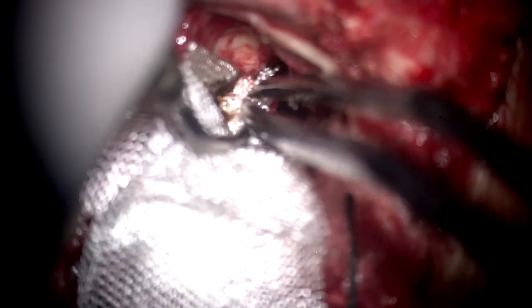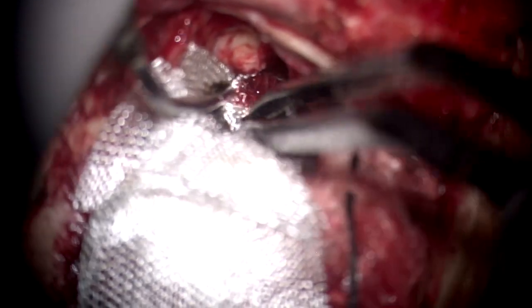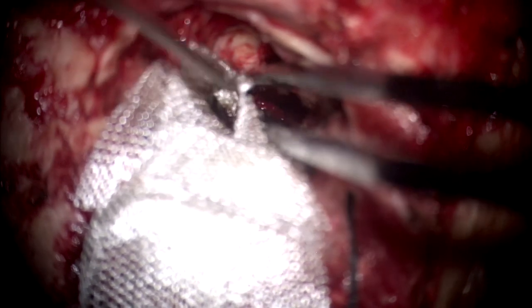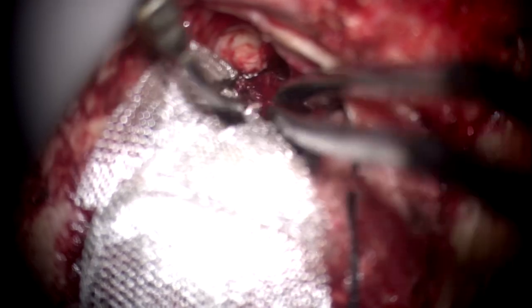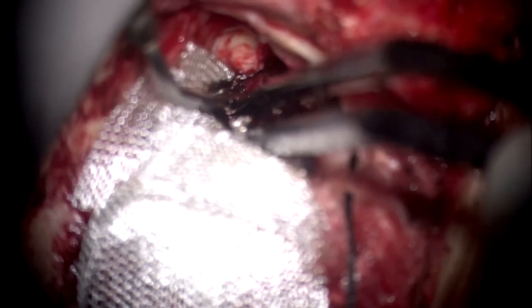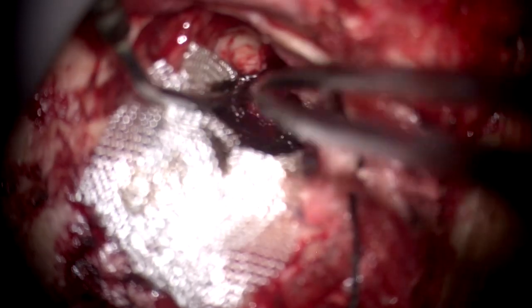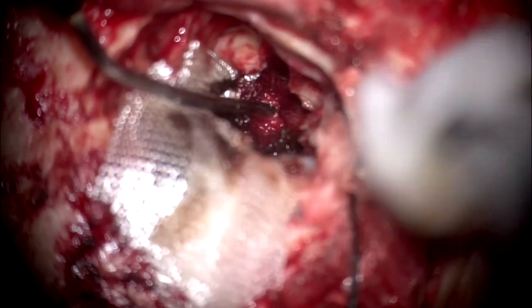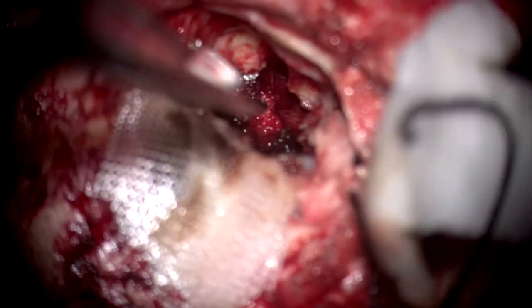So what is your observation, why was it bleeding? Was it from the petrosal? Some vein somewhere, can't comment. How can you say which vein was this? Leave a patty for a while. Remove the surgical. Leaving a patty for a while.